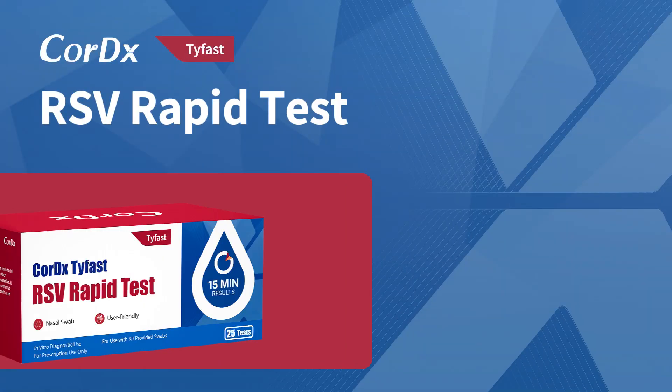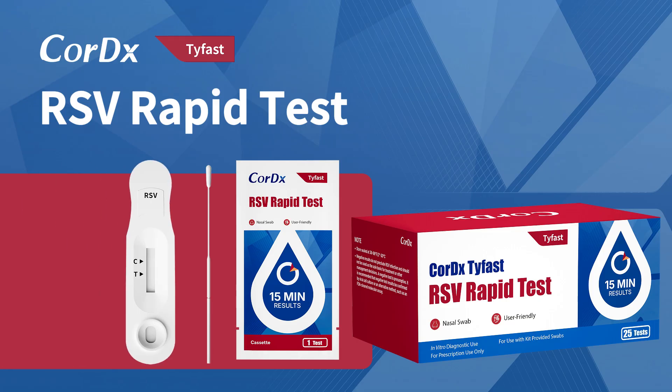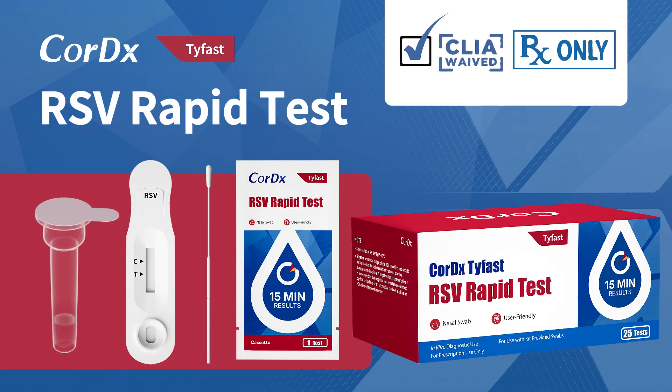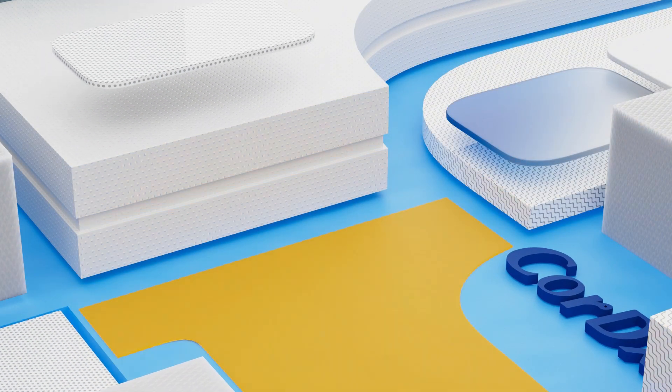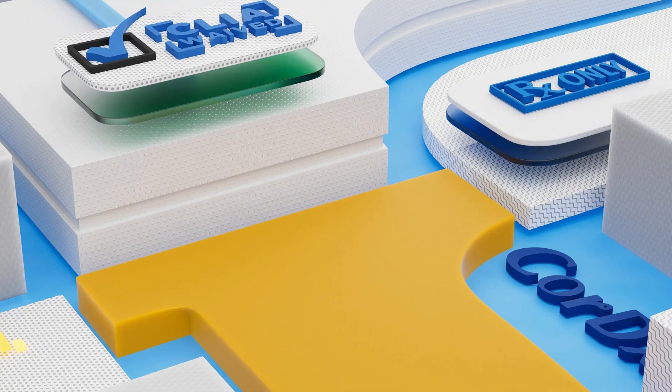Meet the CoreDX TyFast RSV Rapid Test, a simple and reliable way to check for RSV. This test is for professional use under medical supervision and works only with the swabs included in the kit. The test is CLIA-waived, meaning it's easy to perform and approved for anterior nasal samples.